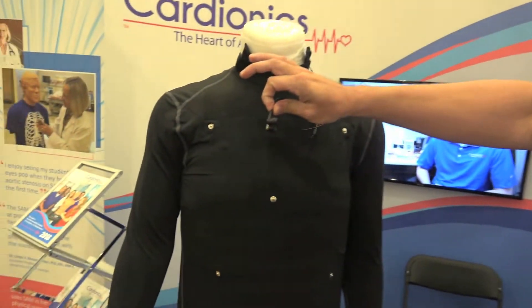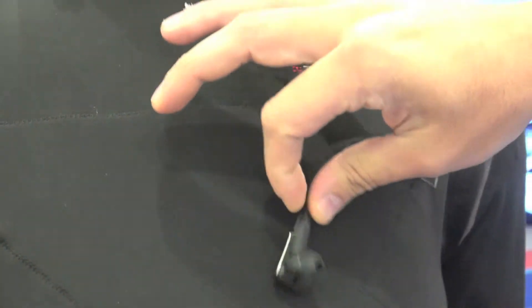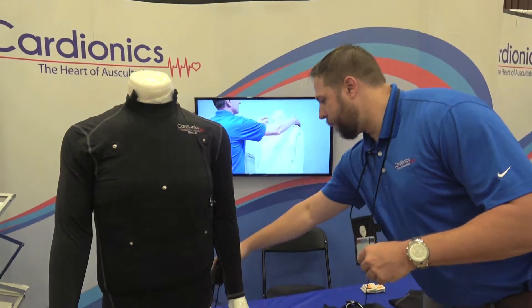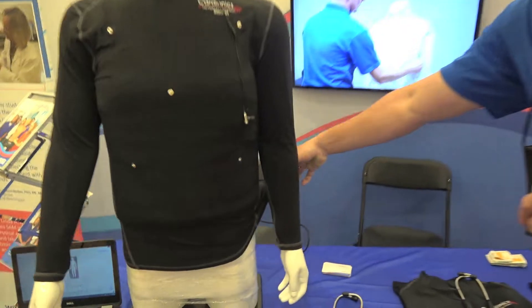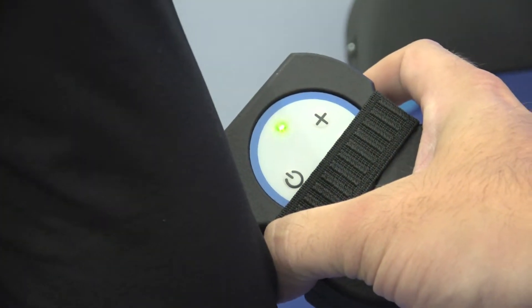There are earbuds that come with it. The director or person running the simulation can essentially tell the standardized patient what to do, whether it's to breathe hard or show distress. It comes with the power pack, and the standardized patient is essentially told what to do, whether to hit up or down for increasing heart rate and things like that.